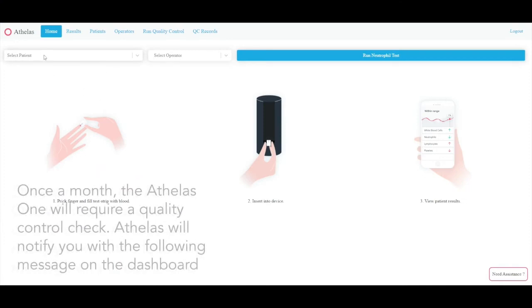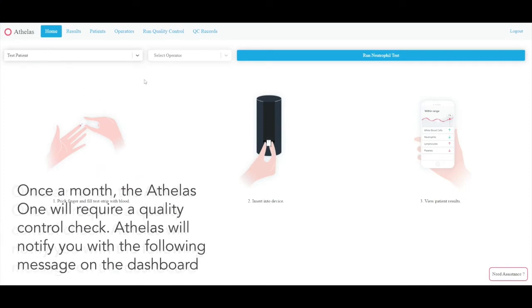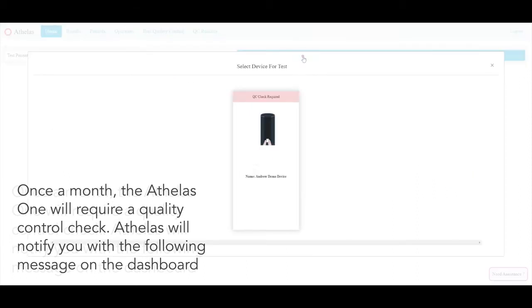Once a month, the Athelas 1 requires a quality control check. Athelas will notify you with a message on your dashboard.